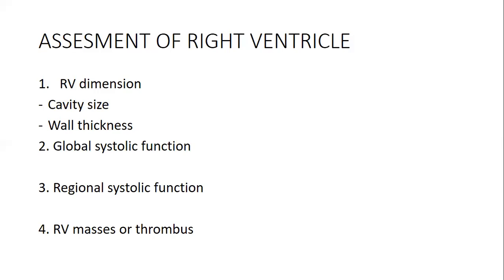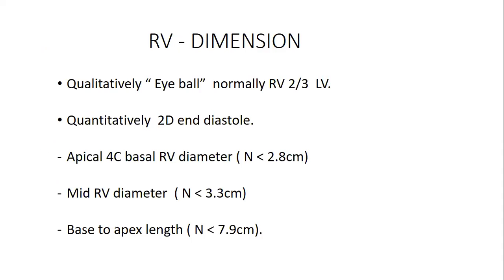When it comes to checking of the masses, am I dealing with a thrombus? Am I dealing with a tumor? Is it benign? That may not be our issue, but the key issue is that as you are assessing the right ventricle, consider the following that I've mentioned so that you guide the clinician.